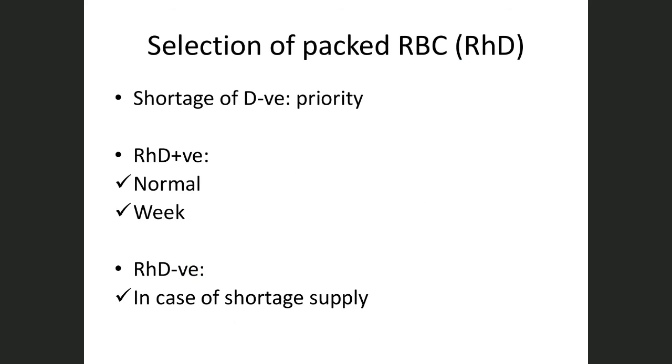Sometimes we don't have enough D negative. So we will have a scenario now and we have to solve the problem. We have a female, seven years old, who needs B negative.